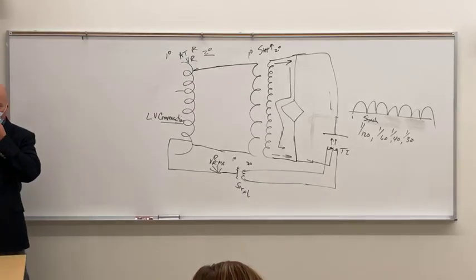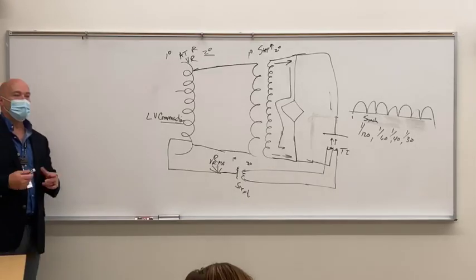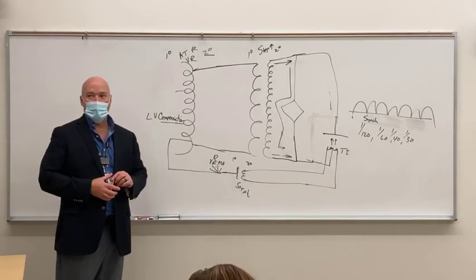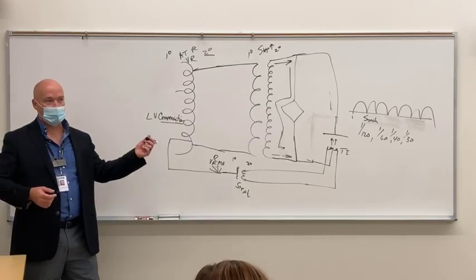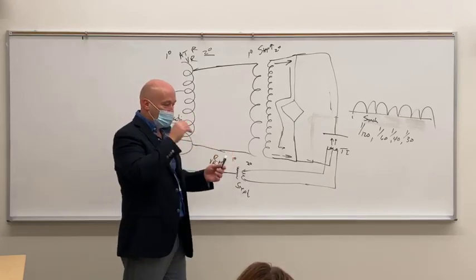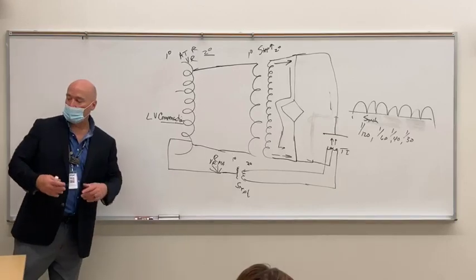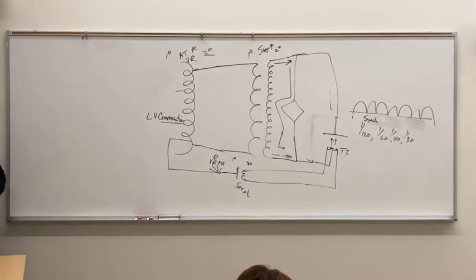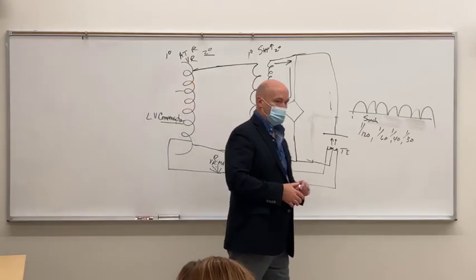So if you apply a current to the N side, you get flow. If you apply electrons to the P side, then the holes go towards the wire and it vacates the P-N junction. You got nothing. All right. So in that way, you can change alternating current to direct current.